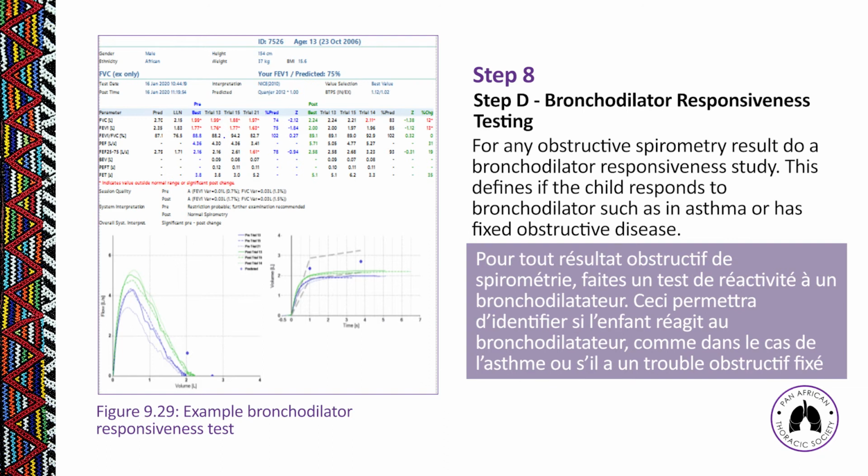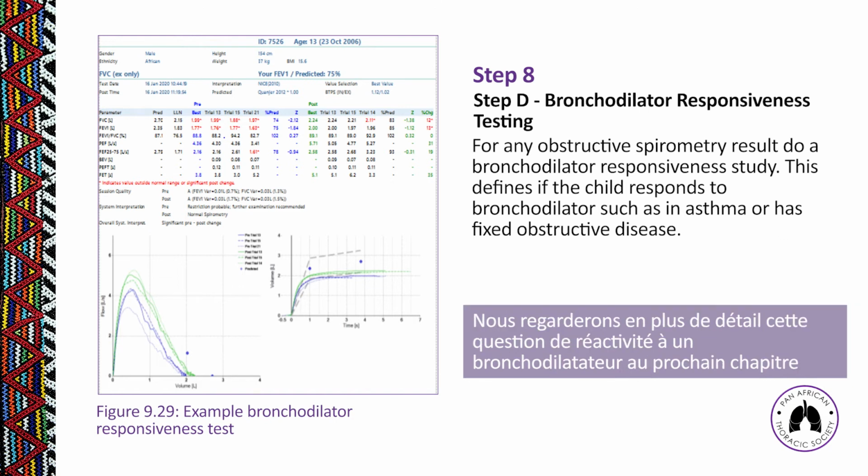For any obstructive spirometry result, do a bronchodilator responsiveness study. This will define if the child is responding to a bronchodilator such as in asthma or has fixed obstructive disease. So we will look in more detail at bronchodilator responsiveness testing in the next chapter.